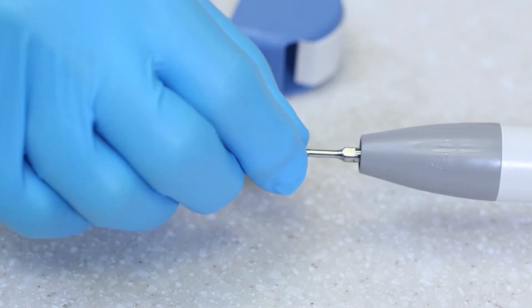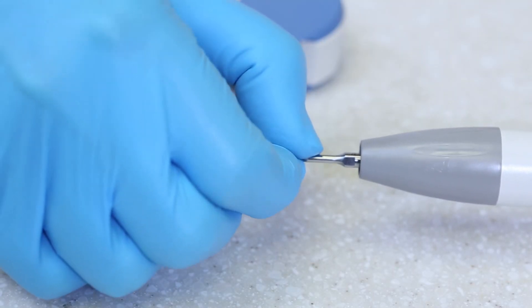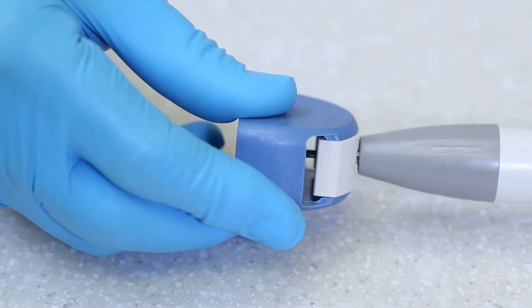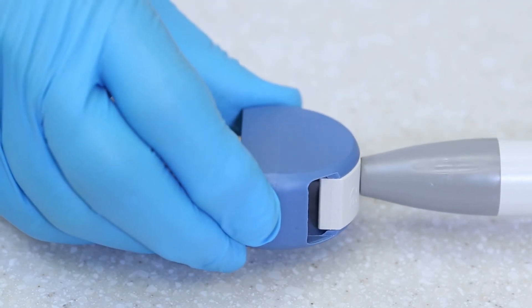If your ultrasonic tip is not vibrating, check to see if the tip is loose. If the tip is loose, tighten the tip with the tip wrench. If the tip is tight, check to see if your power setting is too low.